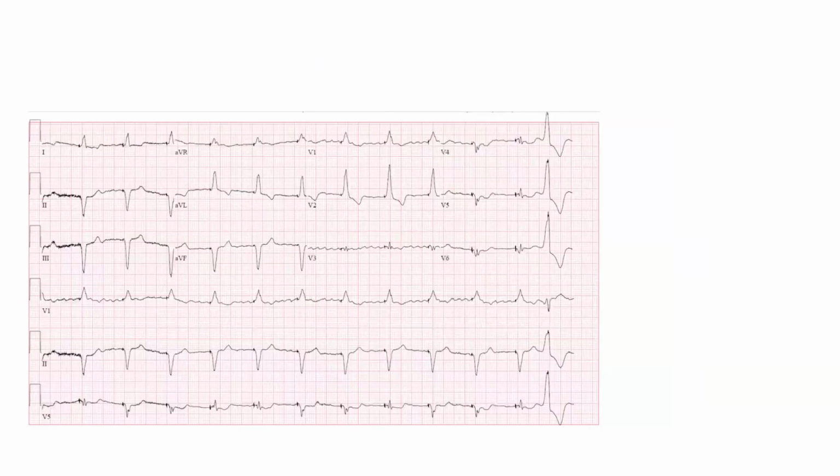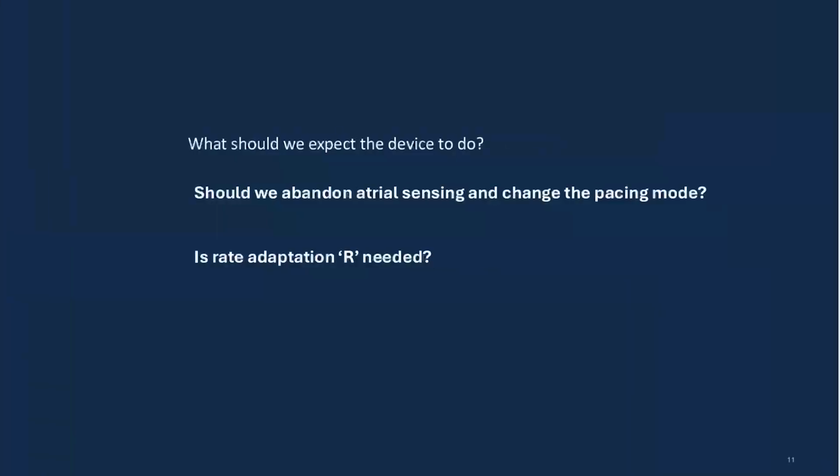Right bundle branch pathology with PVCs. Right bundle. Okay. Wide QRS, yes. Maybe. And the rhythm? This looks like fibrillatory waves. Exactly. So the rhythm was now in atrial fibrillation, which was the main thing I wanted to highlight.